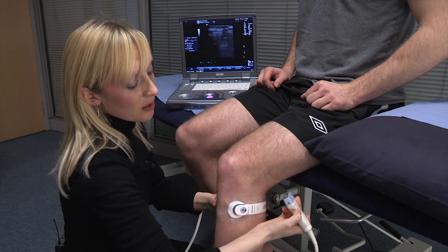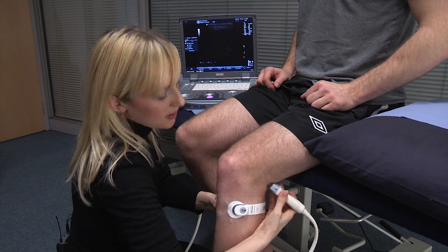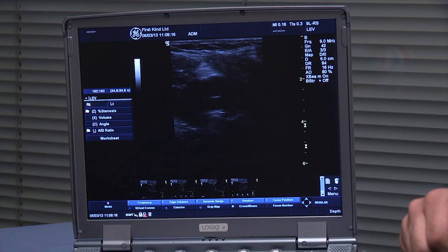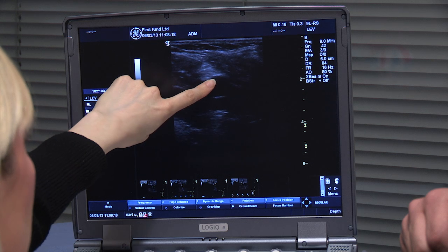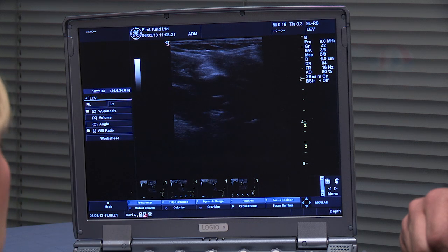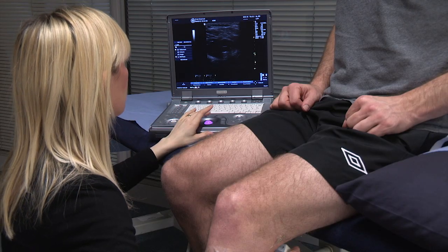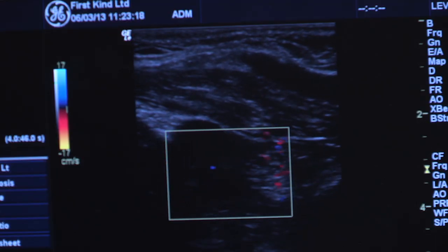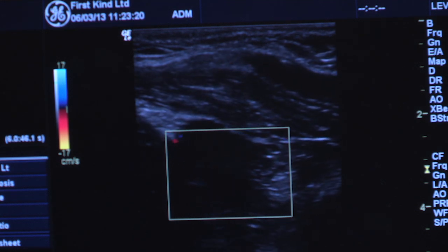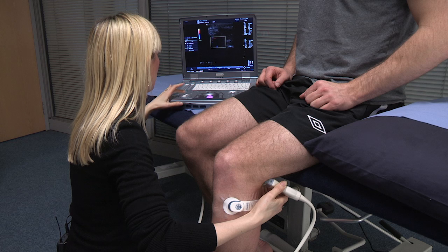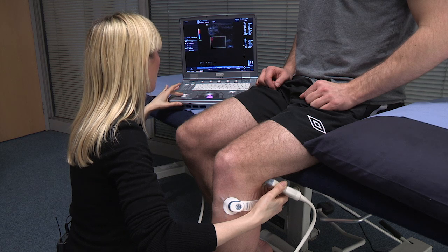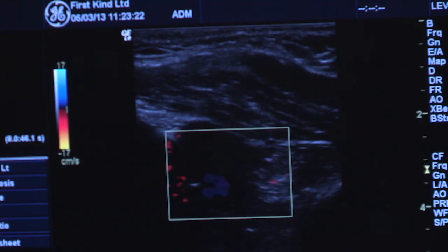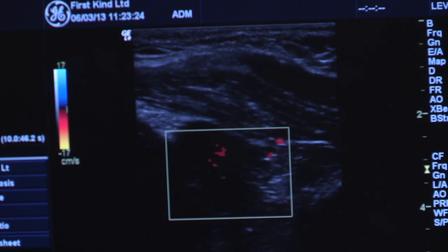I'll just start by scanning behind the leg. I've got the popliteal vein on top and the artery underneath. If I put the colour flow on, you can see the artery pulsating away there and the vein isn't, which is normal. Just to demonstrate the blood flow, what I can do is augment Tom's calf — you'll see the vein just fill up.